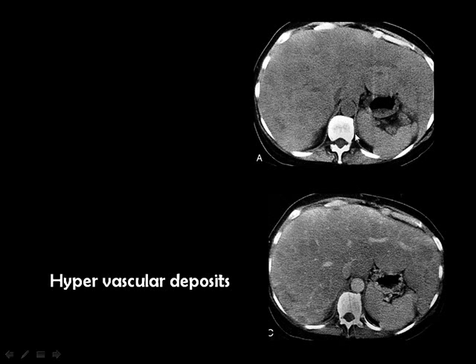This is an examination without contrast material. The aorta is empty of contrast. And this is the examination with contrast material, and the aorta is stained with contrast. The liver, as you see, is markedly enlarged. And if you look carefully in the liver, you may see a focal lesion here, and you may suspect another one here. And if you go to the liver after injection of contrast material, you can predict 2 or 3 lesions here.